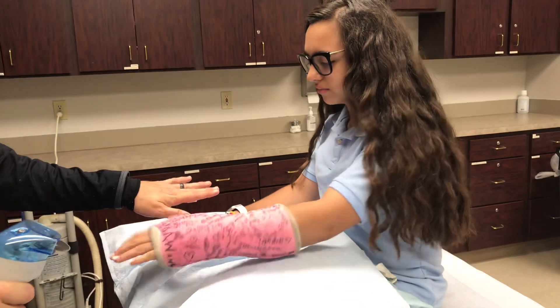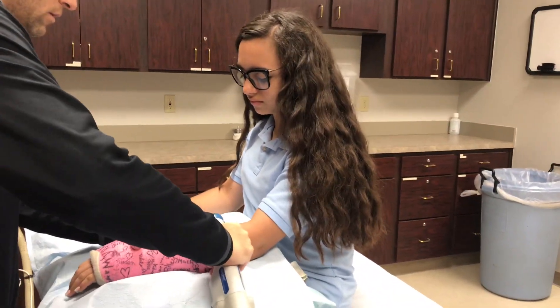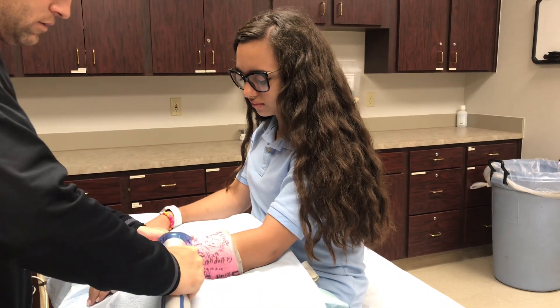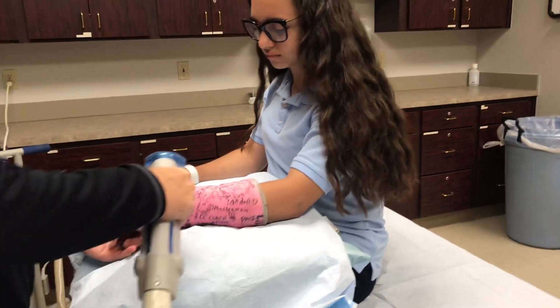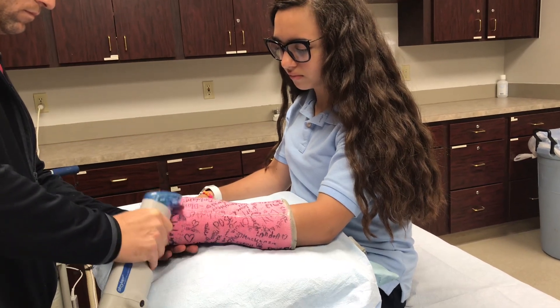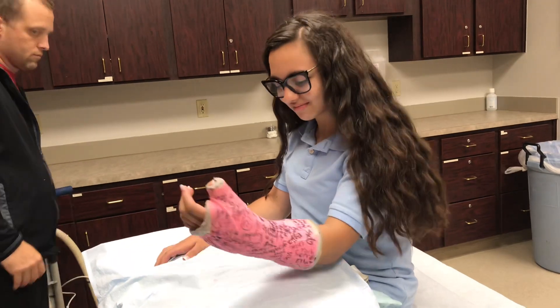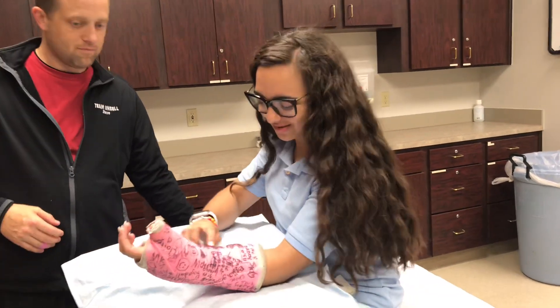Just rotate your hand over like that. There we go. I was hoping you'd do it to Kira.